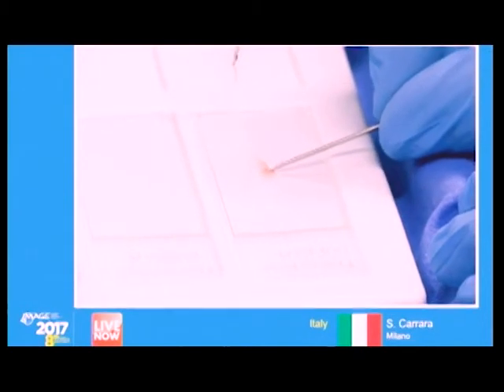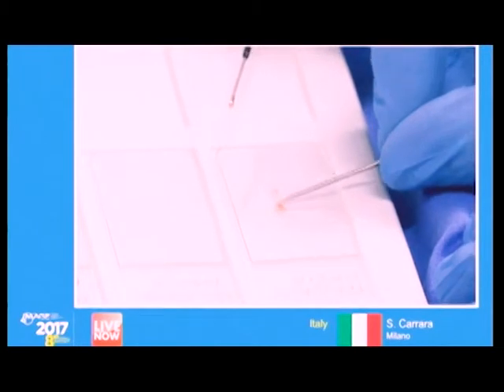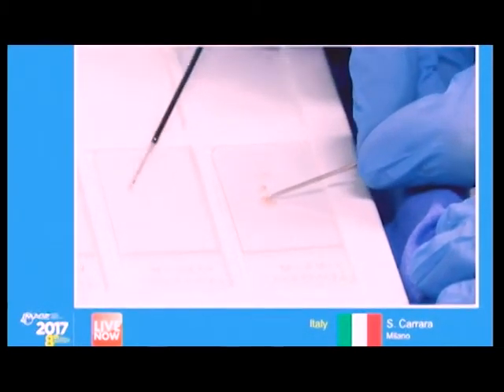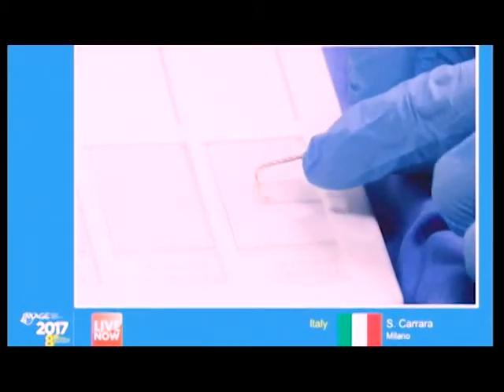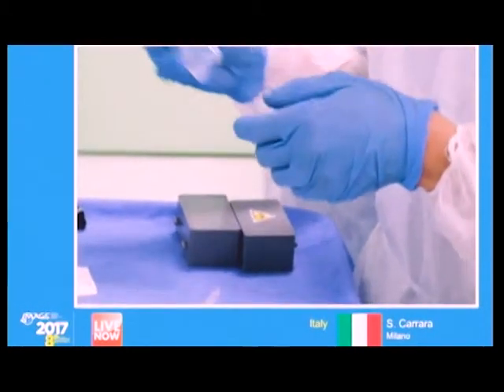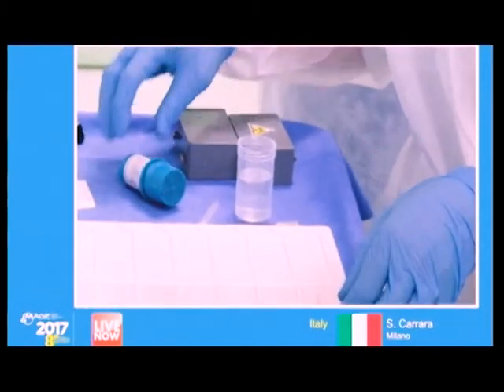See here, there's no blood, viscous. There's all this material, a little bit of mucus, because you see it's not fluid this, but it's mucus. Look this. So I will put the solid part into formalin, and I will prepare the smear for cytological evaluation, and you can also send for final evaluation to the pathologist.